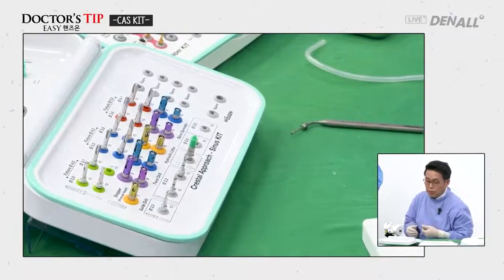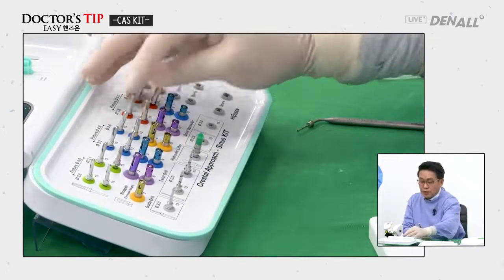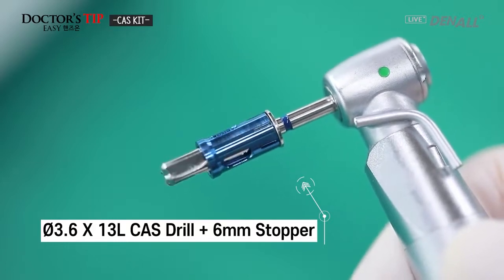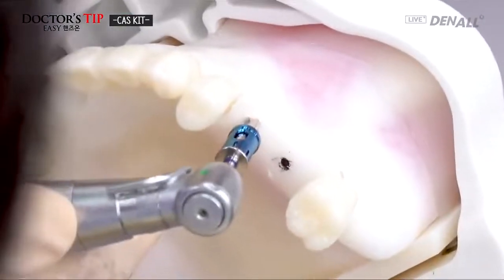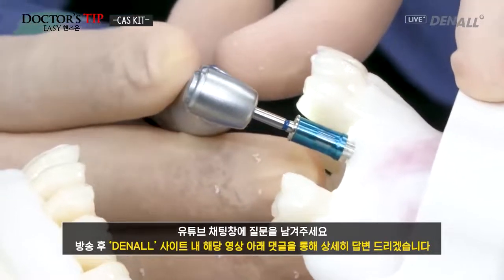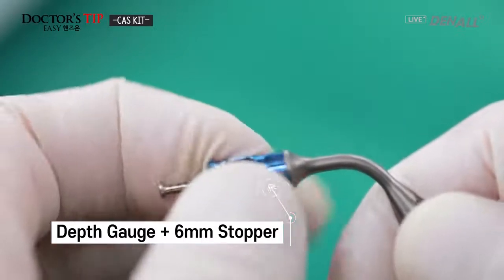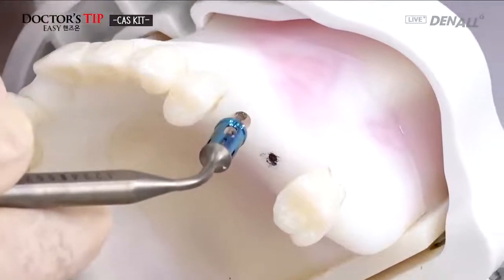Next, the 4.5 fixture will be installed. So the CAS drill diameter 3.6 is used. A 6 millimeter stopper is connected. Because the sinus floor was not penetrated with the 5 millimeter stopper, the drill hole is not opened yet, so the depth gauge is connected with the 6 millimeter stopper to check whether the sinus floor is penetrated.